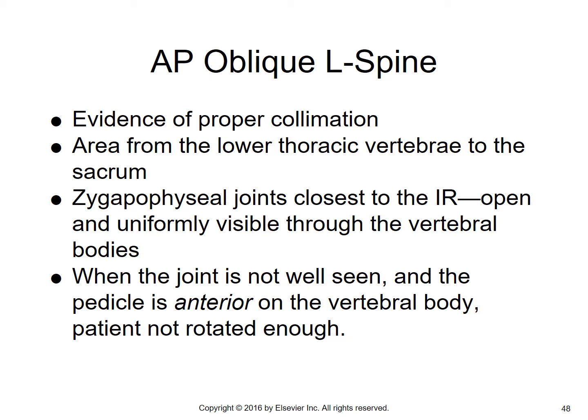Now, sometimes you don't see the joint very well. And if that's the case, you're going to look to the eye of the Scotty dog, which is the pedicle.